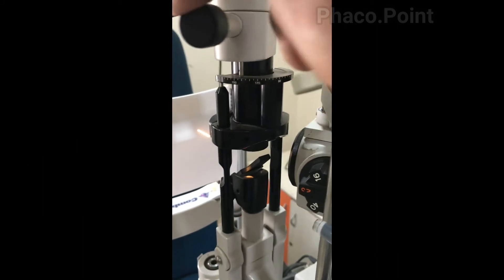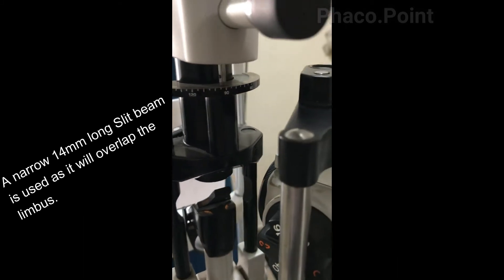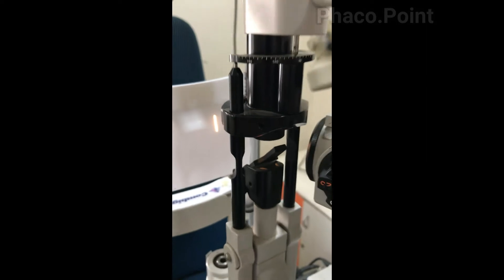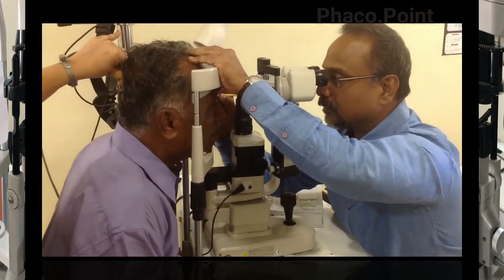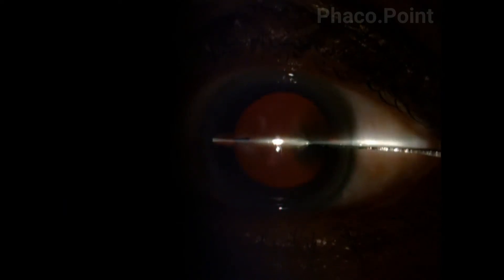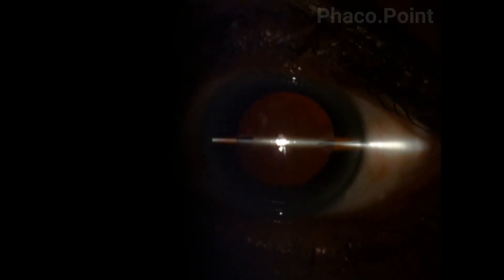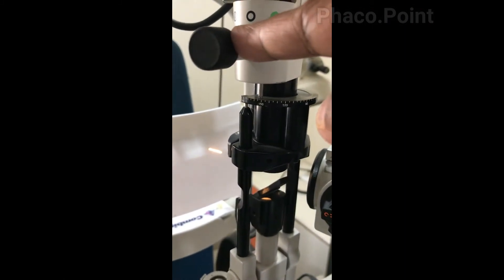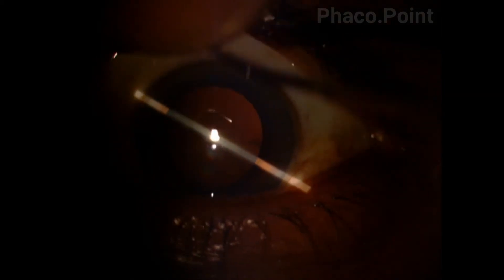So let's take a look at how we can go about with this new marking technique. We start off with the patient sitting under a slit lamp, gazing at distance, under topical anesthesia. I align the 14 mm long slit beam to coincide with the desired axis and make sure that this slit beam passes through the Hirschberg reflex to ensure that you are bisecting the cornea in the correct mid plane, and then by using the hockey stick blade I gently press on the epithelium. After marking the axis of placement I also mark the site of incision in the same manner.